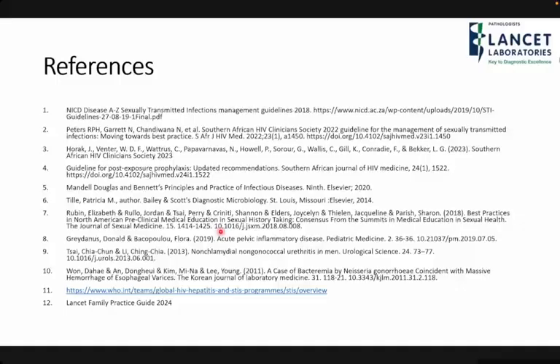And this information is fed to NICD. That's why it's a notifiable medical condition. If we have a resistant gonorrhea, they will pick it up, and our systems are linked. So it doesn't mean Neisseria doesn't grow. It does grow. The problem is how we collect the samples and how we leave them in the ward as well. But with PCR, the sensitivity is high because it doesn't matter whether it's alive or dead.